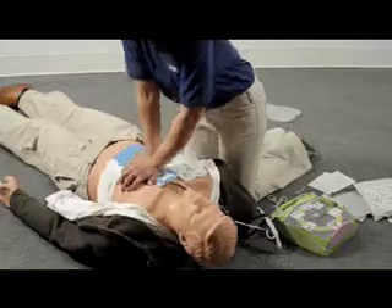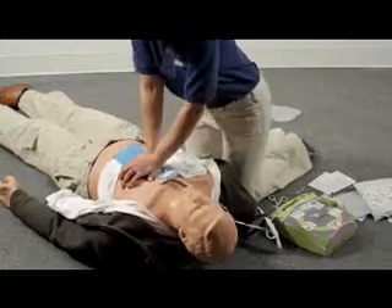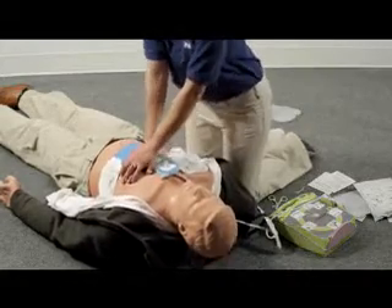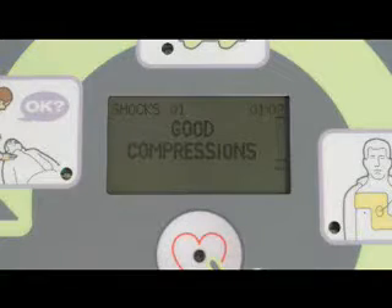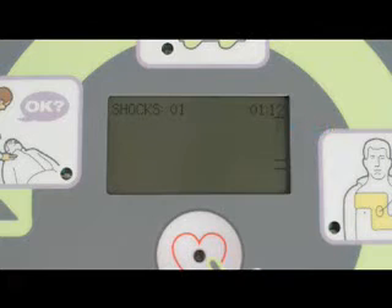After being told to push harder, if your compressions reach at least 2 inches again, the AED Plus will let you know. The AED Plus will also give you a real-time display of each chest compression on the bar gauge. The upper line represents 2 inches, while the lower line represents 2½ inches. Each compression should be deep enough to at least touch the upper line.